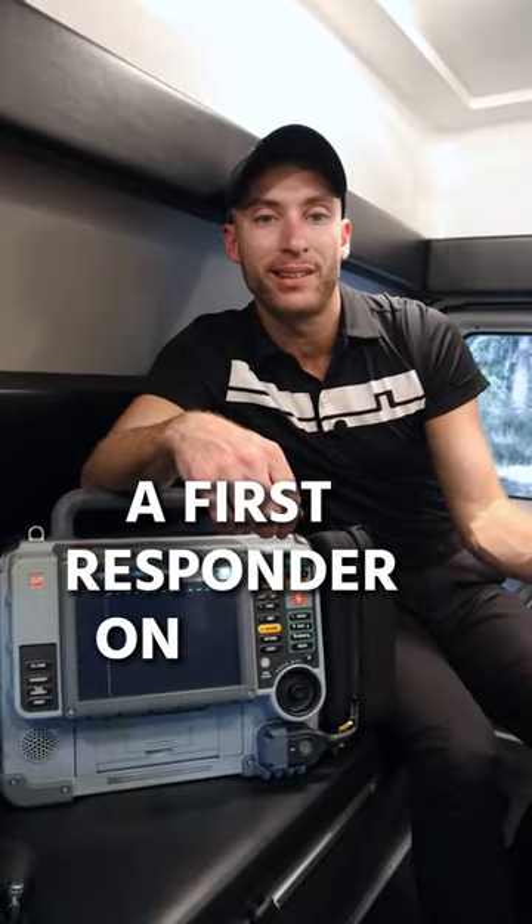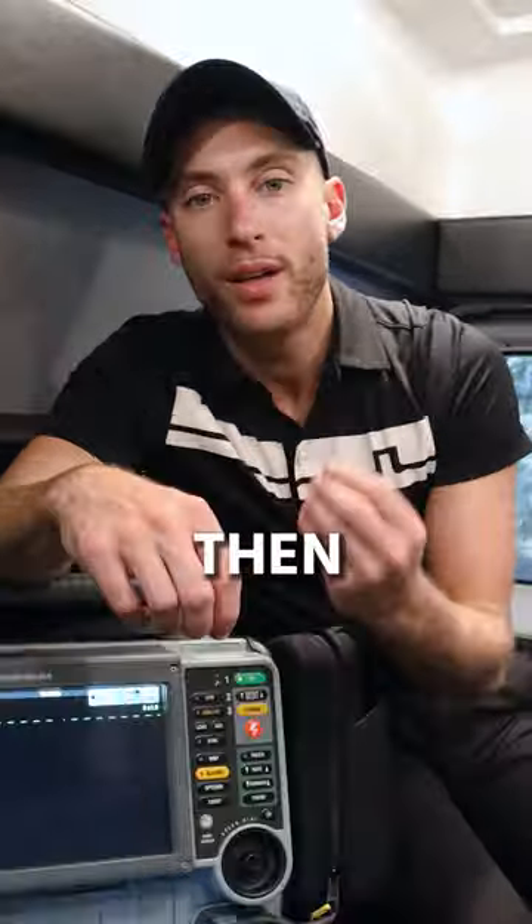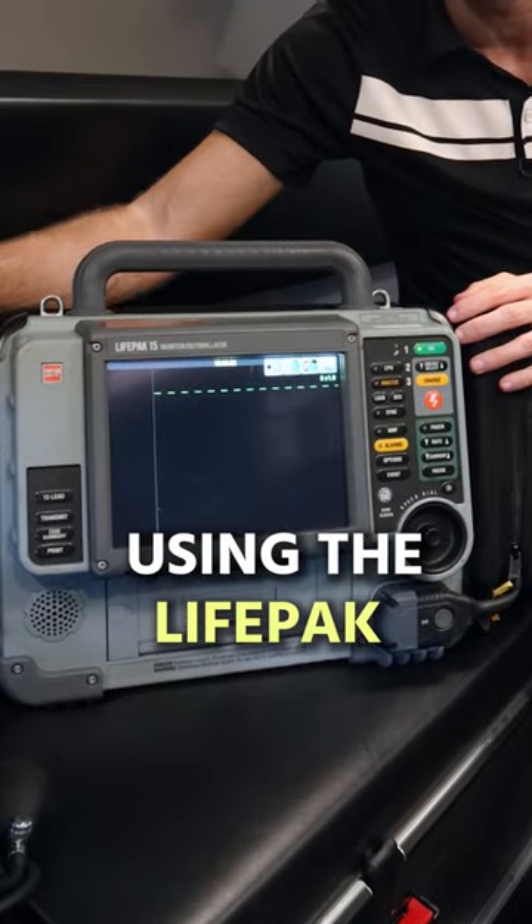You can have a first responder on scene help you with that while you're doing your ALS care. Then you can trend your blood pressure using the LifePack.